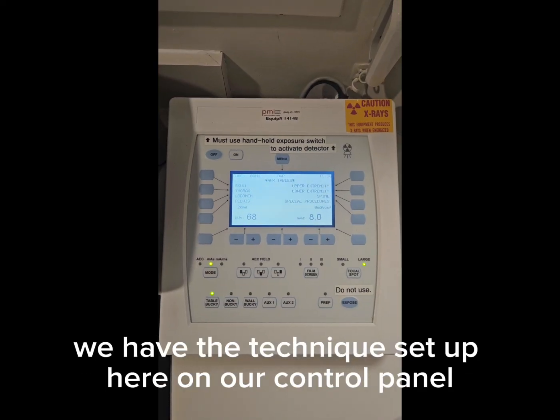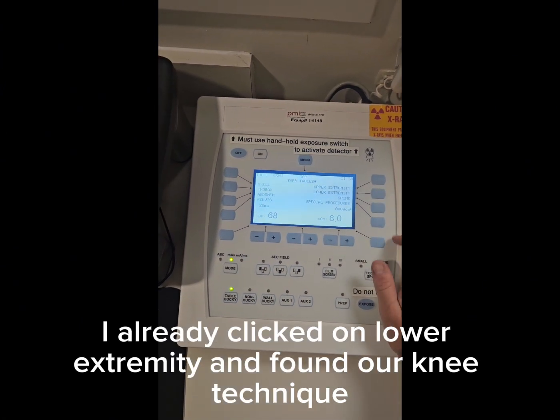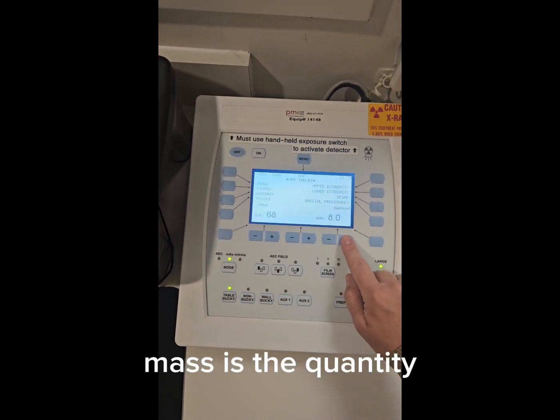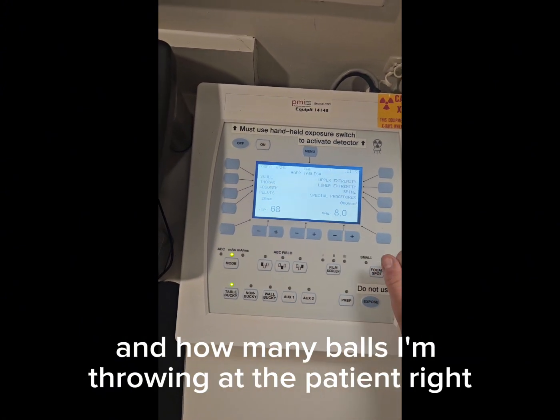We have the technique set up here on our control panel. I already clicked on lower extremity and found our knee technique, and we're going to use 68 kVp and 8 mAs. Remember, kVp is the strength, mAs is the quantity, so it's like how strong the balls are being thrown and how many balls I'm throwing at the patient, right?